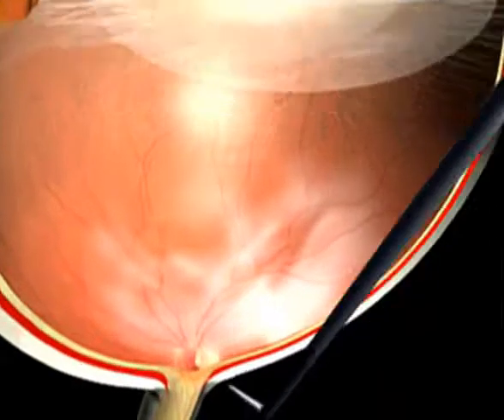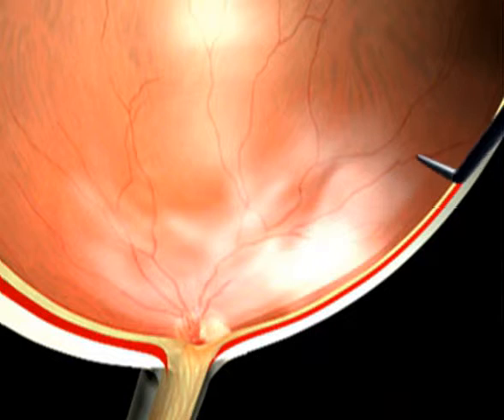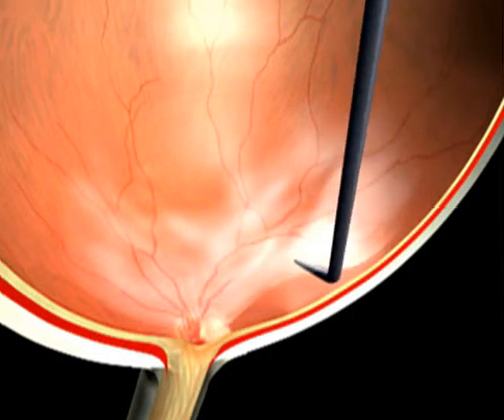In a first situation, things are easy. There is no severe proliferation except in front of the optic disc. We will make a plan of cleavage and separate the membrane starting from the disc and then turning around it. The movements will be then centrifugal and parallel to the retinal plane.